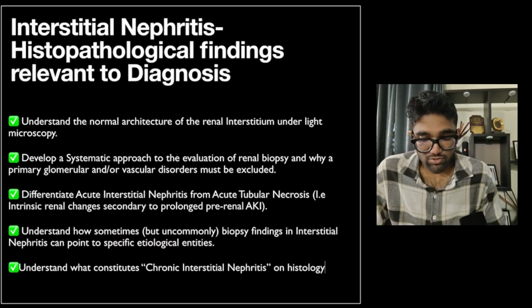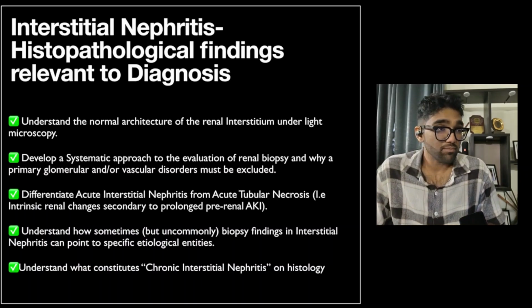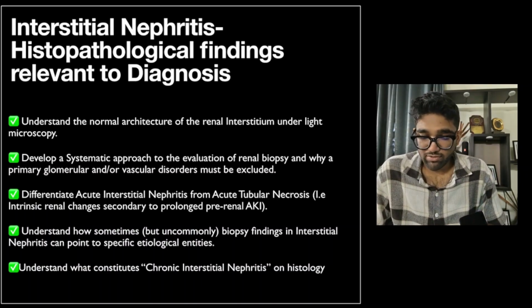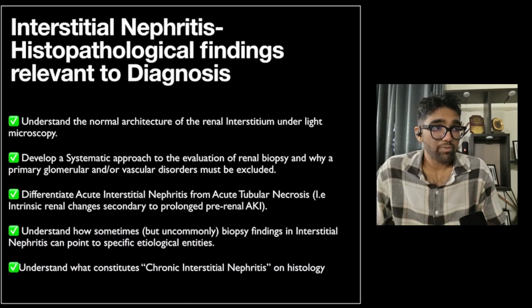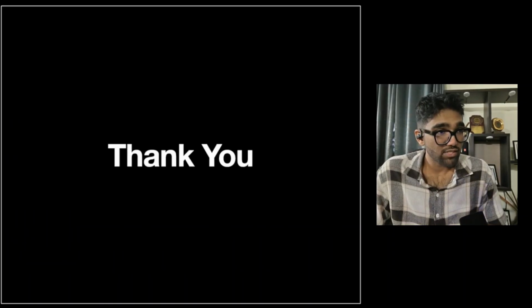Then we finally understood what it means to label a biopsy as chronic interstitial nephritis on histology, and what are the implications of the same. So that brings us to the end of this discussion.